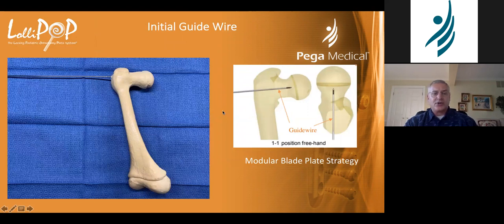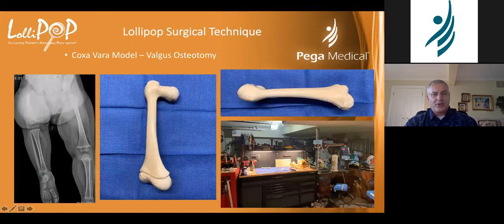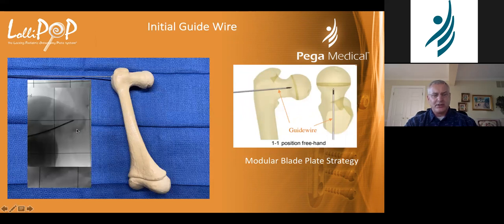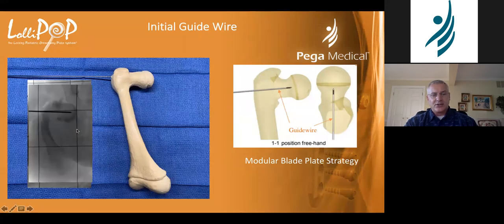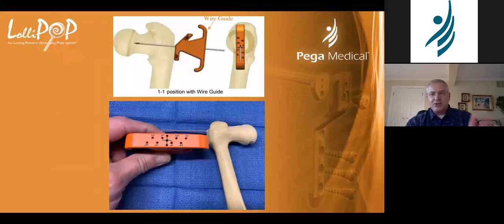If you look intraoperatively, this is the same patient that we just saw momentarily, this little guy. You do an arthrogram and you actually can see the femoral head. Now you can guide your guide wire straight into the femoral head, AP and lateral, a little anterior is okay. Now that's your final position. You really look at it on a true lateral because you want to see this bullseye. So I'm right in the middle of the femoral head. I know where my guide wire is, and that's where my chisel is going to go. And if you put your first wire in and you like it, but you're not super happy, this is a great little instrument.